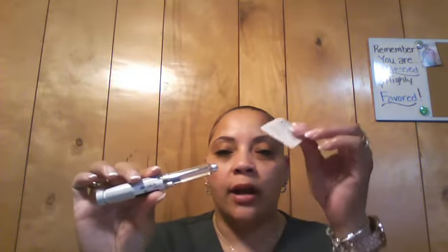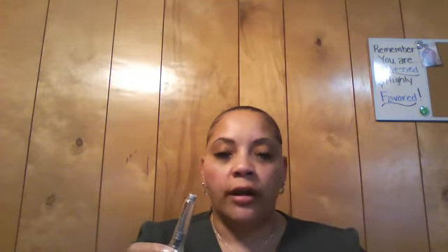working my way out, away from the injection site. So I'm not going to open all this because I only have one. So I will clean the hub. You would take the cap off, and this is what it looks like. I would take this alcohol pad if it was open, and I would scrub the hub in a circular motion. I will let this dry.